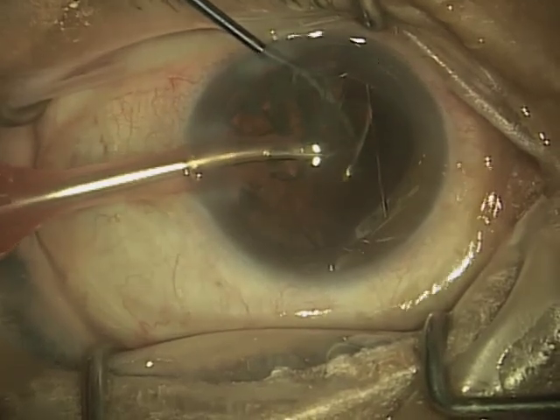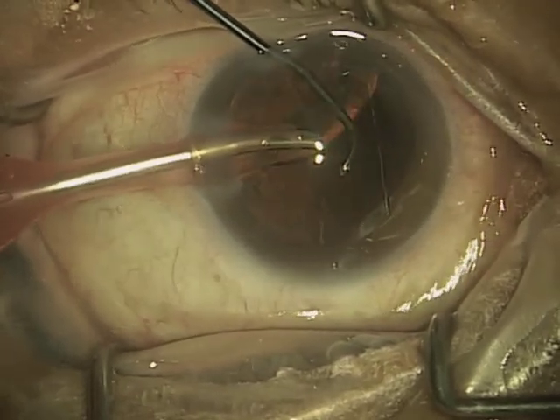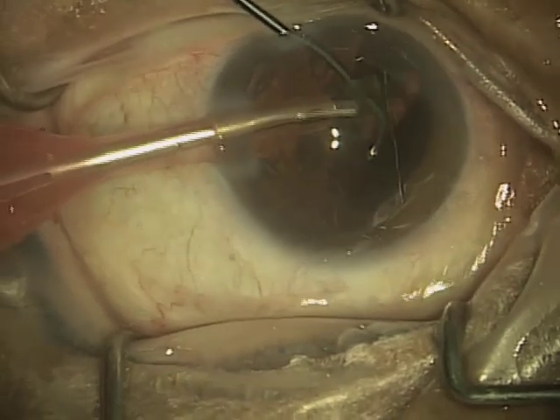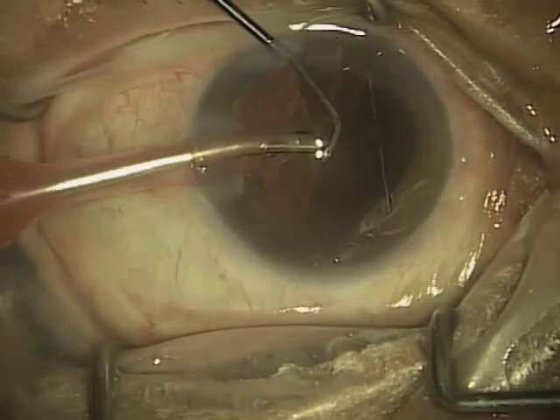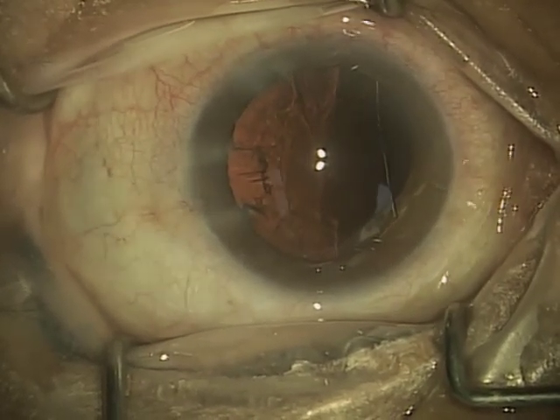This is one of the advantages of using a second instrument. As you can see, as the epinucleus is being removed, you get a nice what we call red reflex — you're actually seeing the reflex off of the retina, though you can't see the retina itself. Now you'll notice it's pretty clear except over on the side where you see a little bit of haze — that's what we call the cortical material.